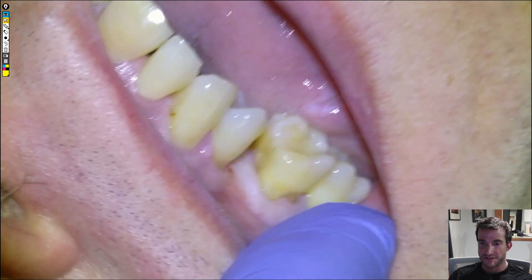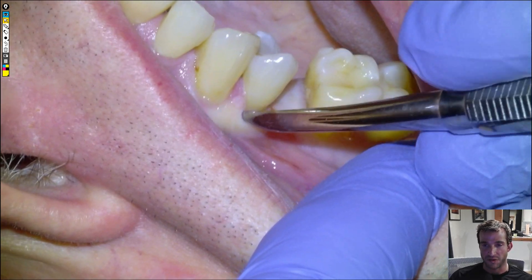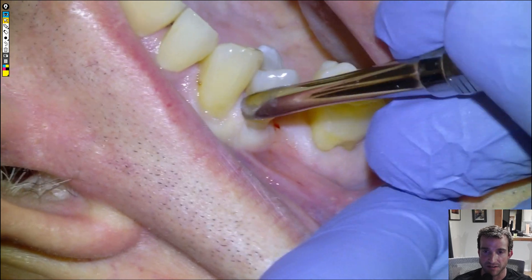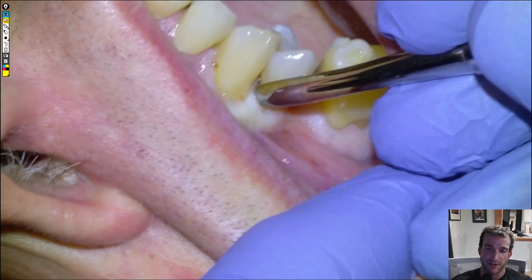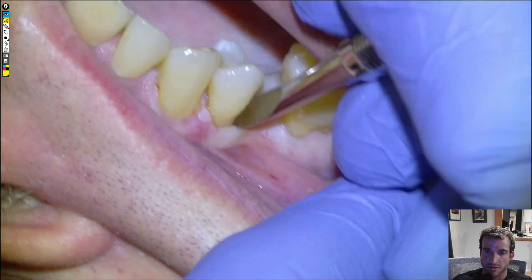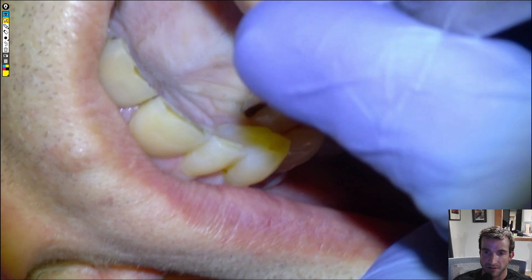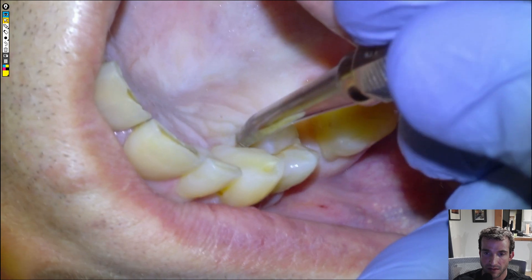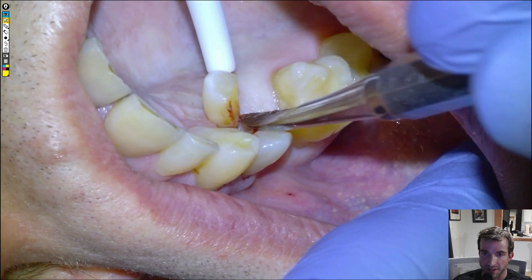We'll use a periosteal to separate the gum tissue. We're hoping the whole thing comes out in one piece, which obviously it did from the intro footage, but we'll really take our time because there's a good chance the roots will separate and leave one root in the socket, which can be difficult to retrieve. We'll spend some time separating the gum tissue from the cervix of the tooth. That little lingual wall is going to give way — you can actually see that the pulp is exposed; it fractured right through the nerve, so this is going to be a very painful situation for the patient.